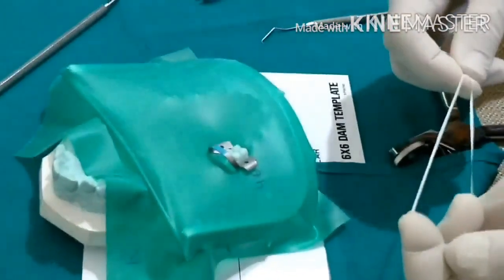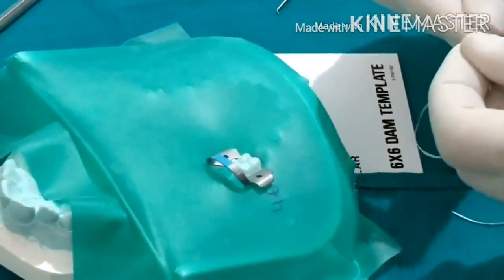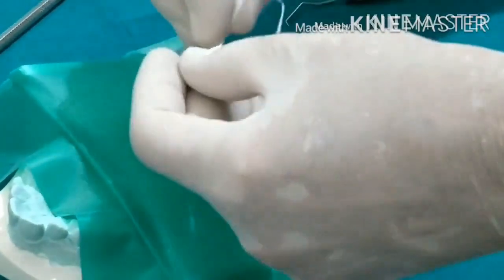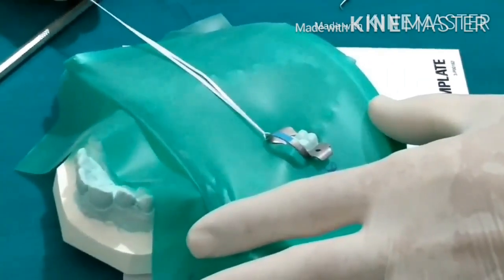In the beginning when you are first applying the rubber dam, and until you have crossed a hundred applications, always make it secure with the help of a floss. Either tie it like this and keep it handy so it can be pulled out in case the clamp escapes your forceps into the patient's mouth.